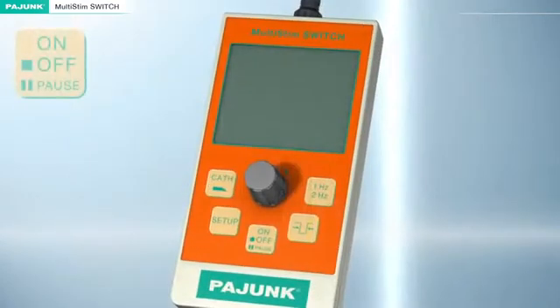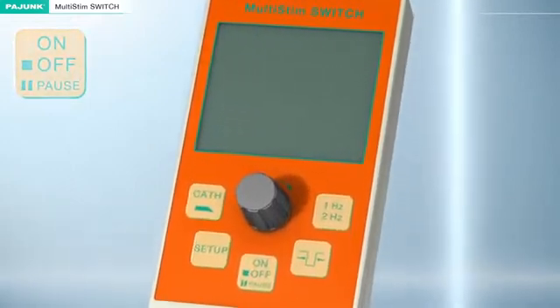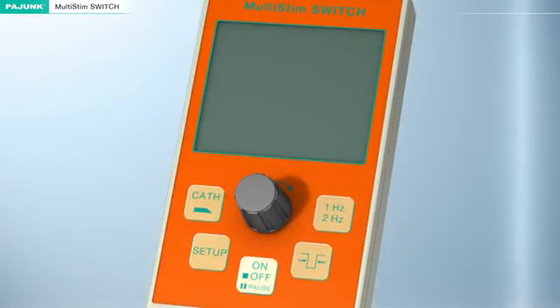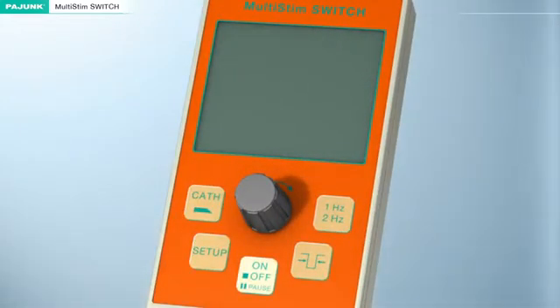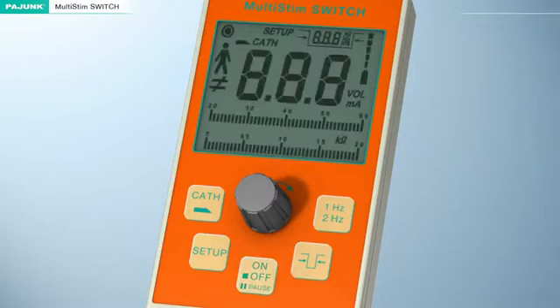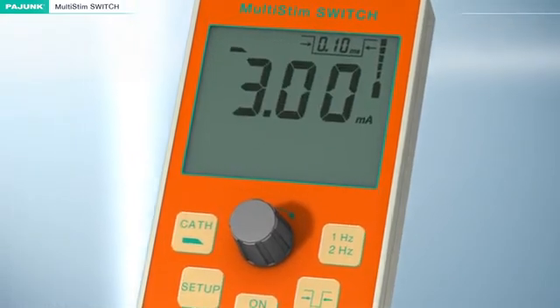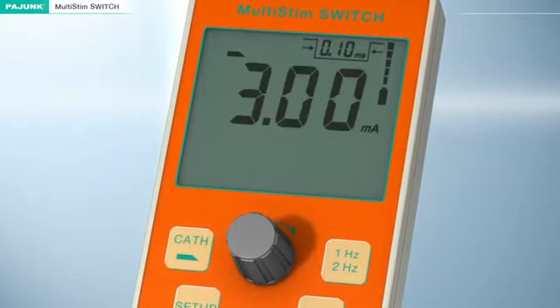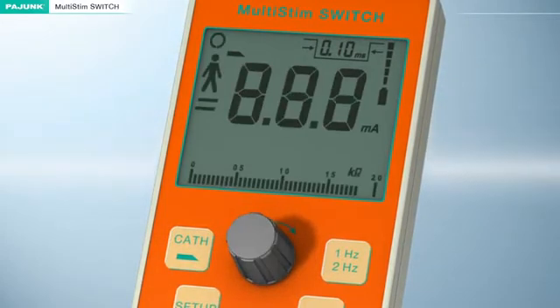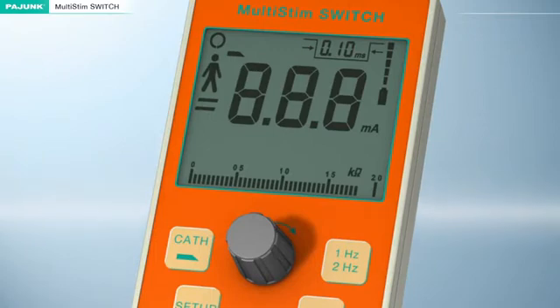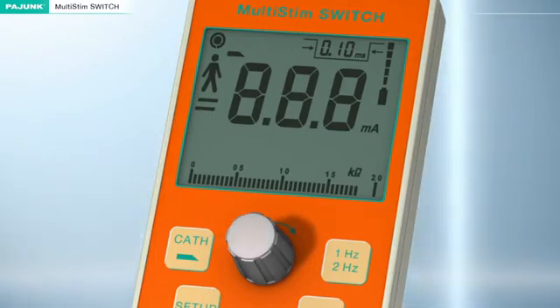On/Off/Pause key: Press and hold the on button to start the device. The device will then automatically initiate a self-test sequence, then switch to pause mode and the LCD display will start to flash. Depressing the turning knob will deactivate the pause function; repressing will activate it.